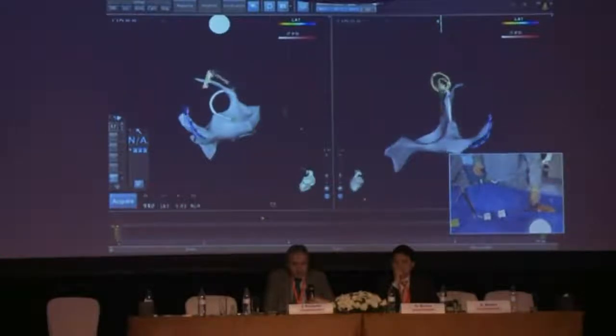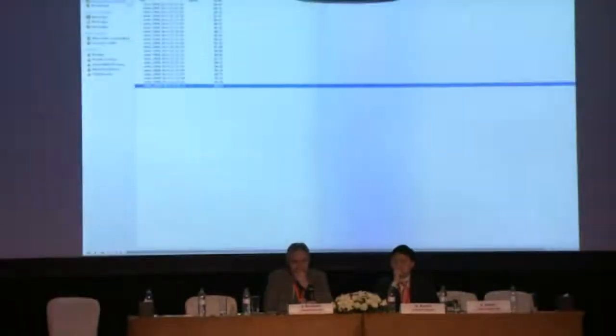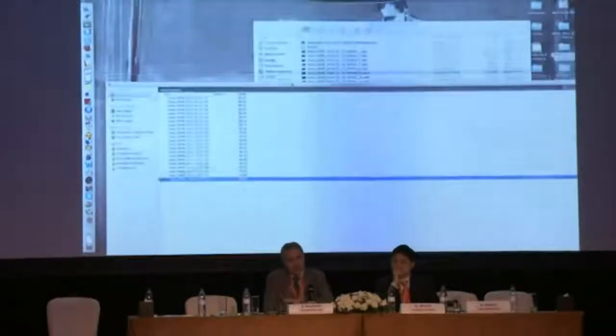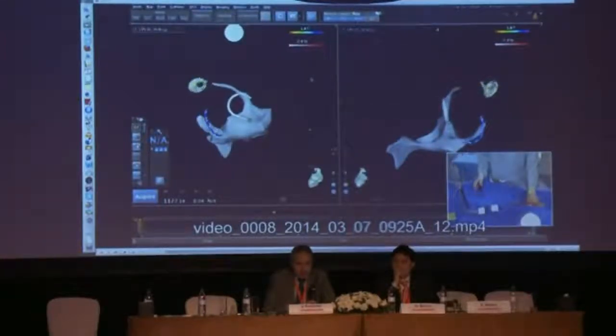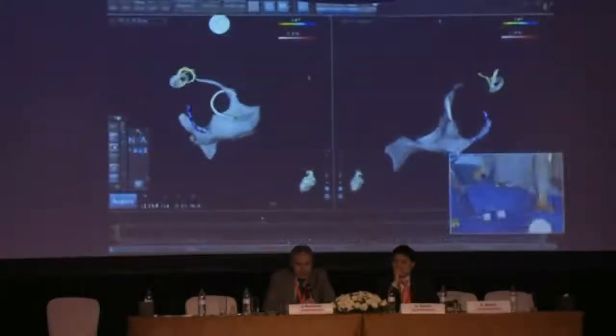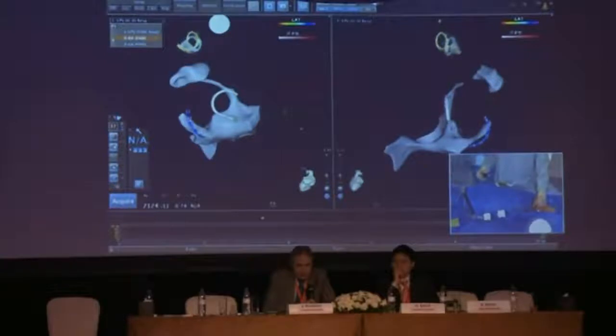My next task is to get that pulmonary vein catheter into the left lower pulmonary vein here, and I know it's the left lower because it's behind the coronary sinus in the left lateral position, which was the right-hand view we saw there, and it is lateral in the left atrium. So now I've done a respiratory compensation, and I'm recording geometry of the left pulmonary veins. Neil, our technician, is going to take off the right atrial view in a minute just to make life a little bit easier so we can see what's going on.